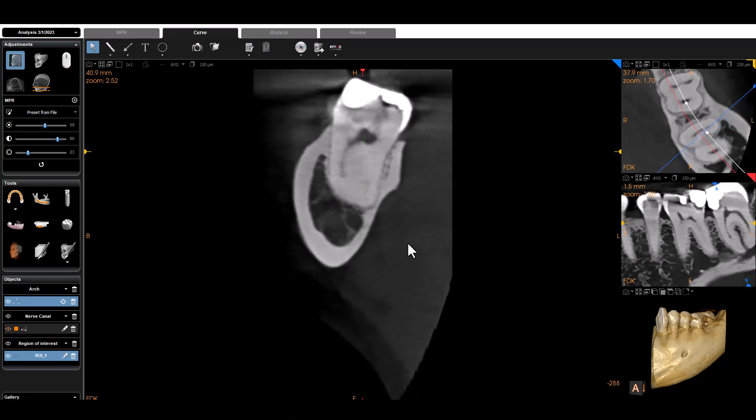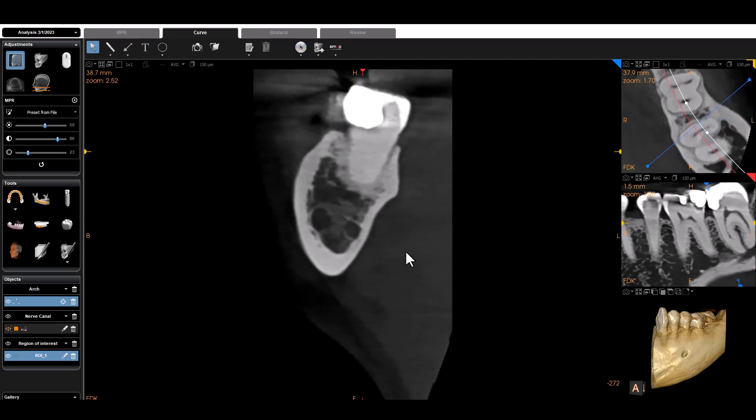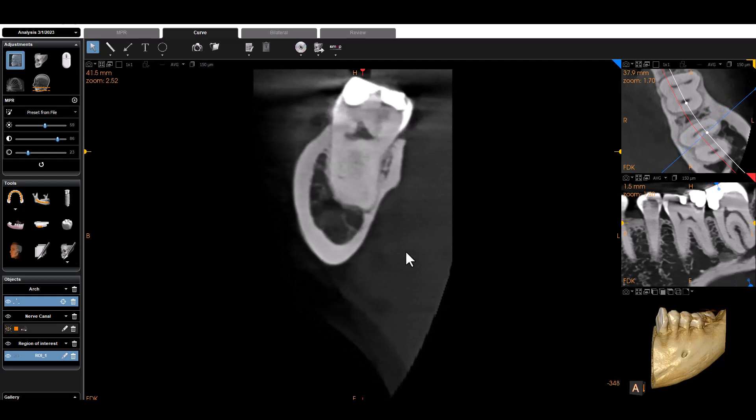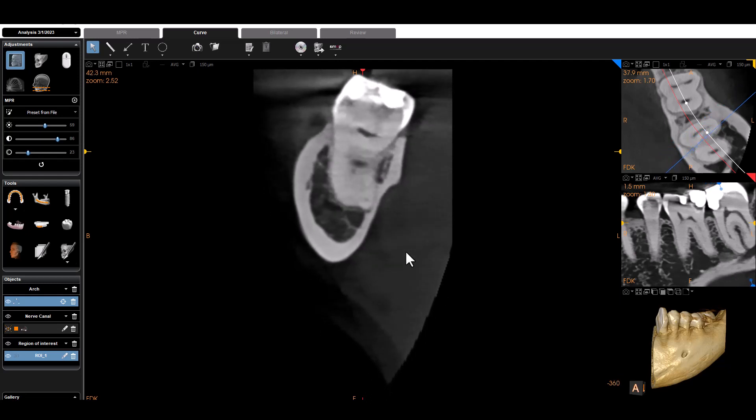I'm really seeing the same thing as the panoramic curve — as I slice through, everything looks very, very normal. And in fact it was normal; there was really nothing wrong with her. She could go on vacation, she did go on vacation, she had a good time. It put her mind at ease. It was a really good situation that we were able to take the cone beam and definitively rule out that there was anything wrong with her tooth.